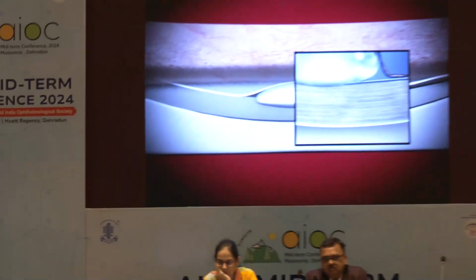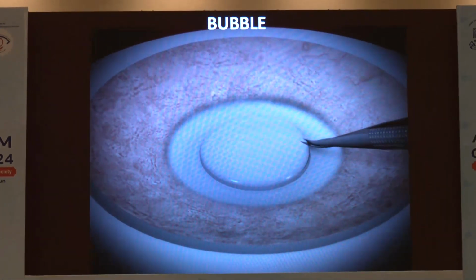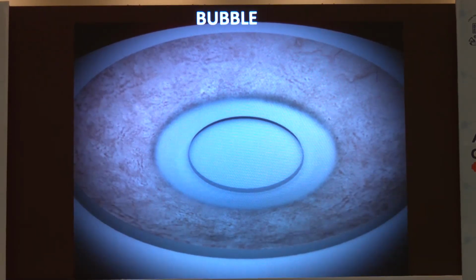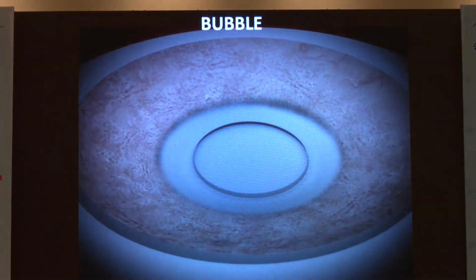Yeah. So the advantage of PDEK here is because we use the Dua's layer, I am getting an additional 12 microns of tissue there, which makes my graft a little more sturdy, easy to manipulate. And I do get to use the younger donor tissues, the advantage being a higher specular count to start off with. But one thing, like Dr. Rishi mentioned, if you don't get a bubble in one eye, the pair eye is going to behave similarly, so please do not go for the pair eye. And since we're dealing with younger donor corneas, we will end up getting a tight scroll, unlike a DMEK graft.